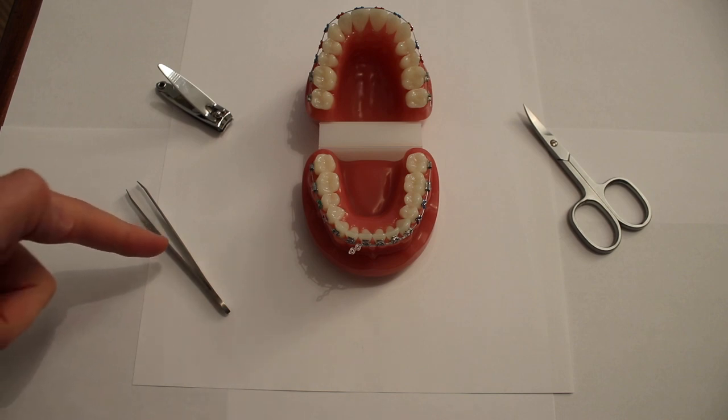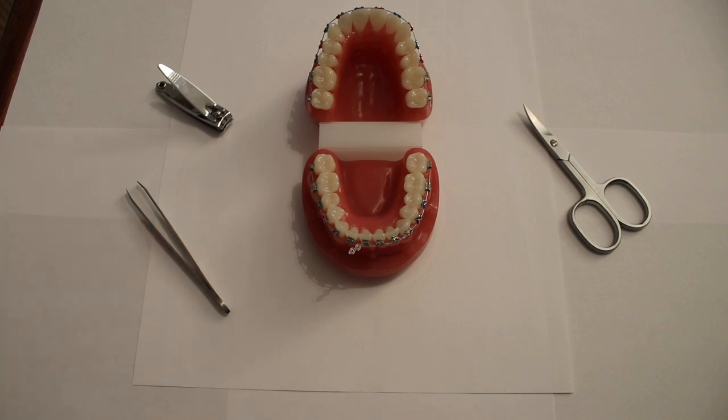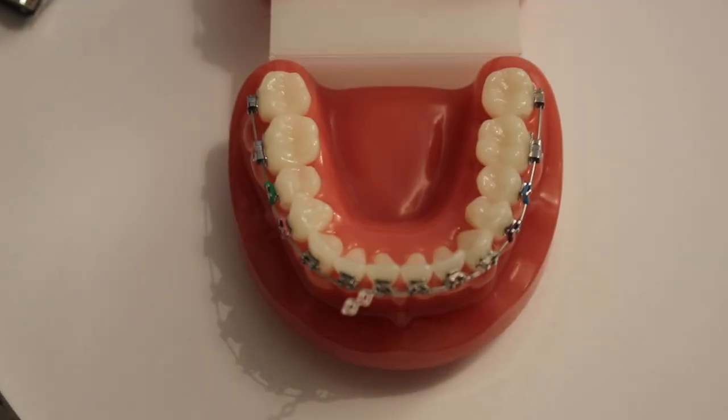You may need a pair of tweezers to pull the elastic away from the other parts of the brace when doing this. Please ensure that you are careful.